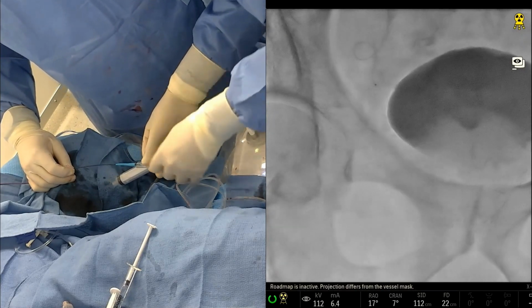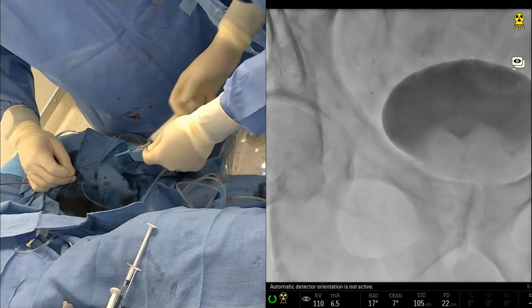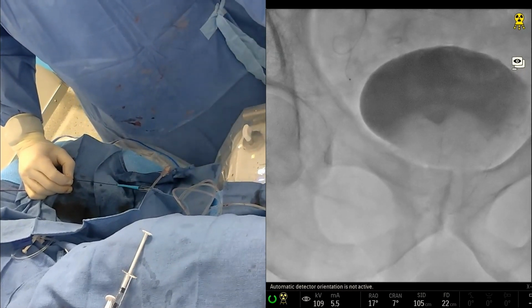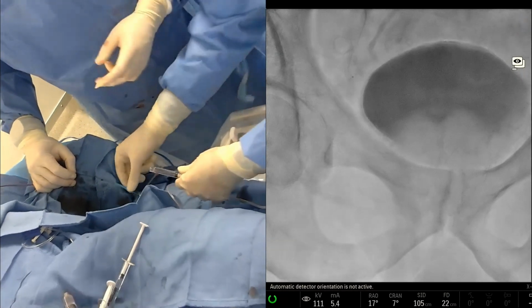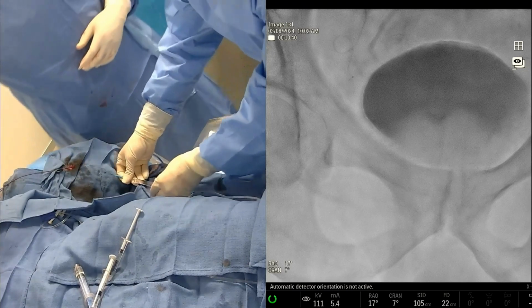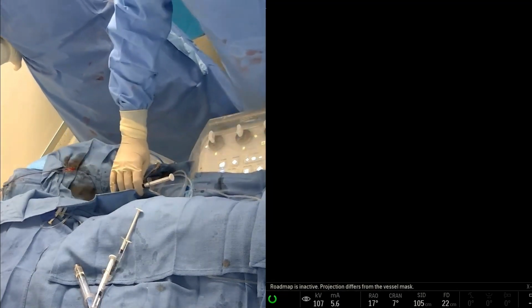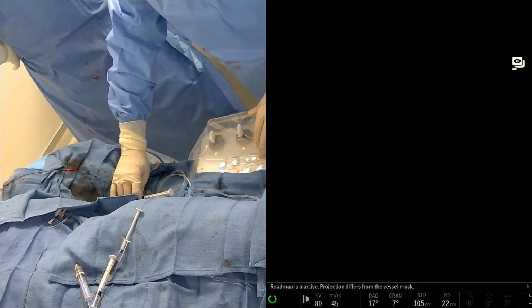But you guys will see in a few minutes, there's a big difference in how you inject an end-hole catheter with glue than a balloon tip catheter. And so we're much less deep oblique here. We're going to do a run, then we're going to do nitro. You good? I was going to mag out a little bit.